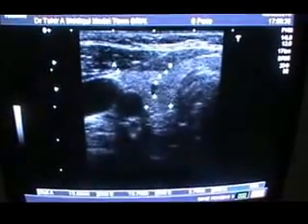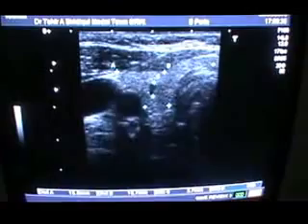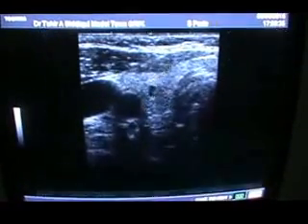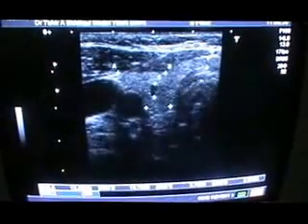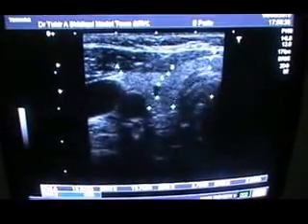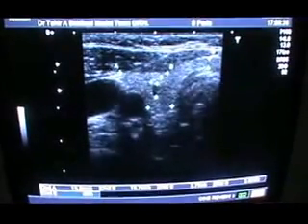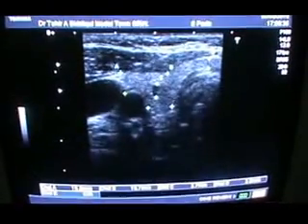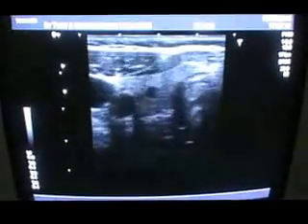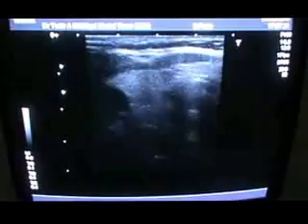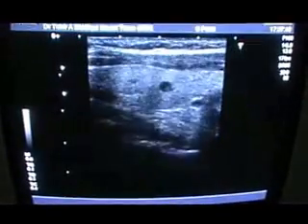This area is representative of the isthmus, which is approximately 2.5 mm. This is the cartilage, this is the tracheal air. The right lobe of the thyroid is normal by all parameters — there is no calcification or focal mass seen relating to the right lobe of the thyroid in the transverse view. And this is the longitudinal section of the right thyroid gland.